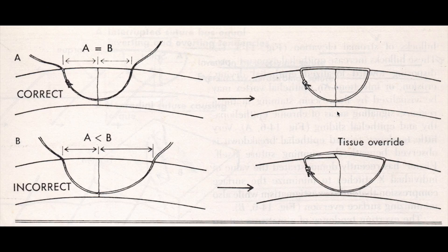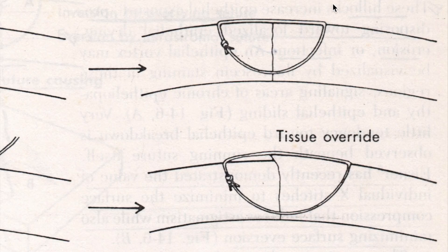Broken sutures are bad news for the patient because they cause a lot of irritation when the patient blinks, or they act as a conduit for infection. We incise the suture in the overlying part away from the knot, and then we pull out the overlying limb from the side where the knot lies. The suture is pulled out from the same side where the knot is.